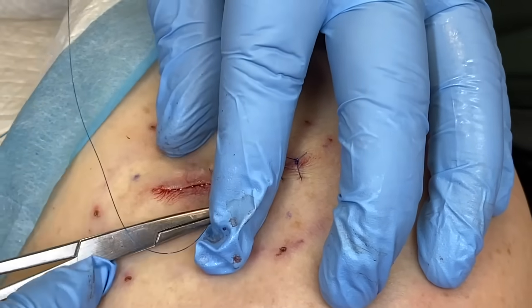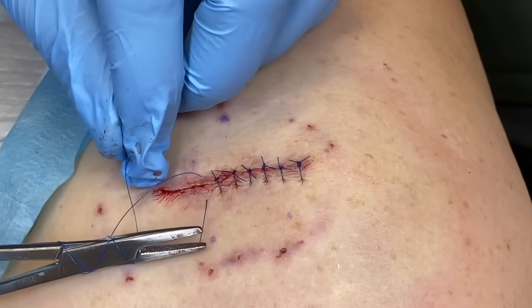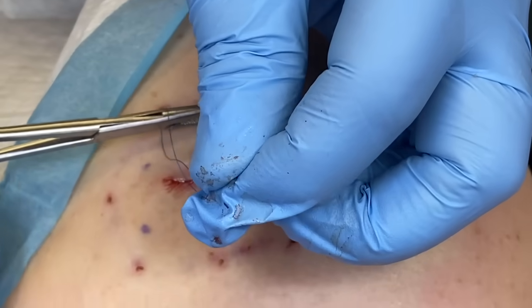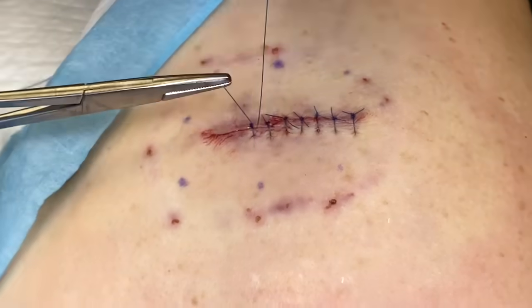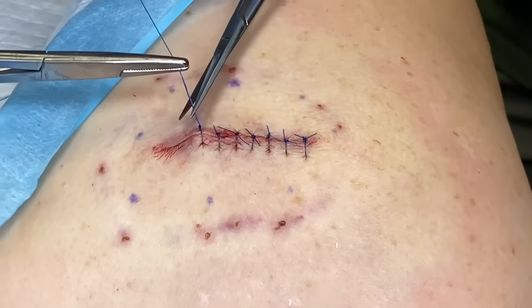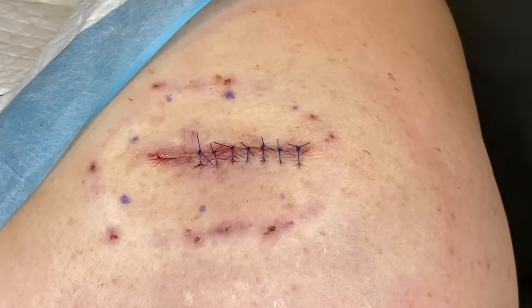Do you want to do it from that side or this side? I think we do it from this side. Or I can go with the other side. No, your choice, whatever you're comfortable with. Once you're stitching, you're the boss. Oh really? Yep. You're both fired. Exactly. I did nothing. That was Rada. But you want to fire them after you're done the job. Finish the stitch, then fire them, when I become the boss.